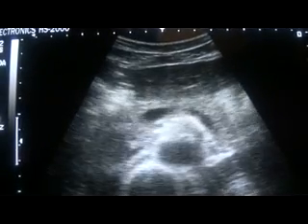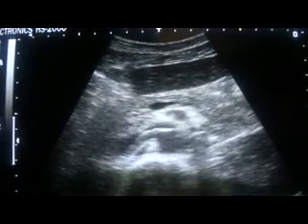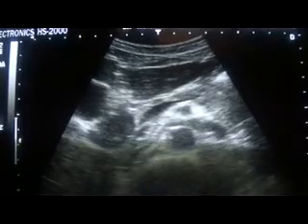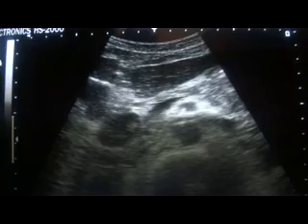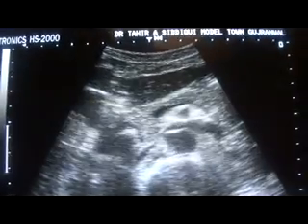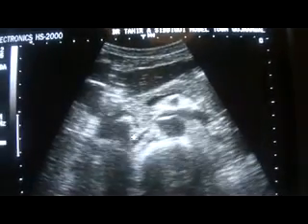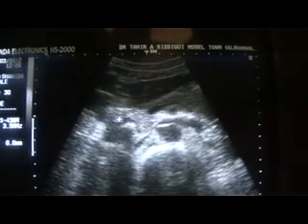I've tried to explain to you the pathologies, the normal as well. This is the gallbladder, clear of any calcifications or debris or focal lesion. This is the wall of the GB, which is 1.8 millimeter, and these all serpentine shaped structures you are seeing are the dilated common bile ducts.